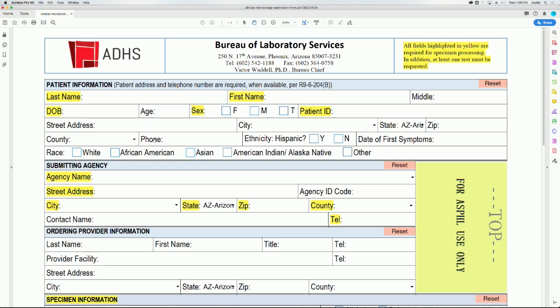Beginning with patient information. Type in the patient's last name and first name in the appropriate fields. For demonstration purposes, we will be using the name Jane Doe.